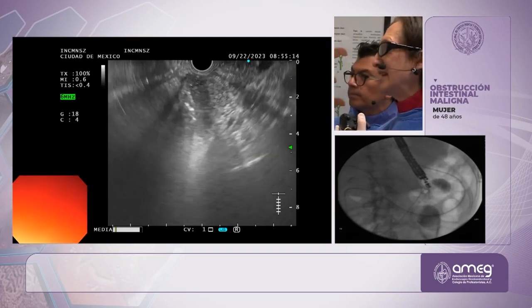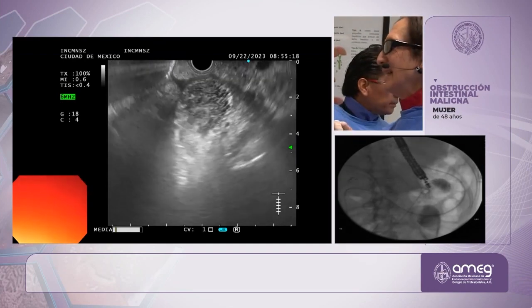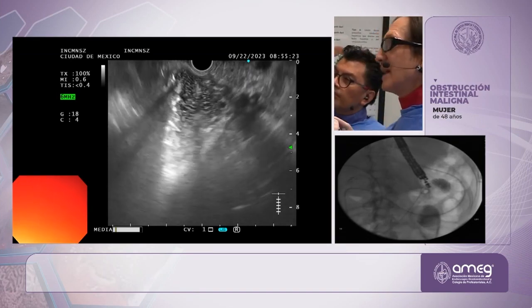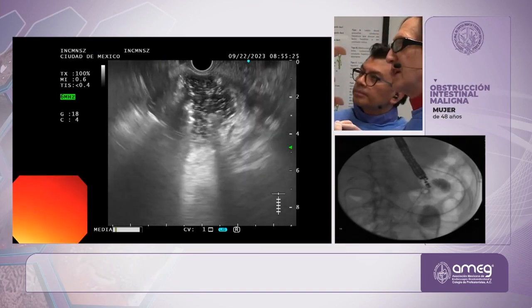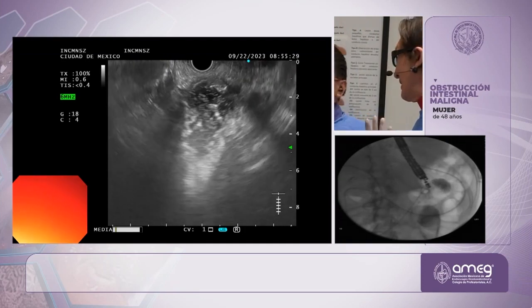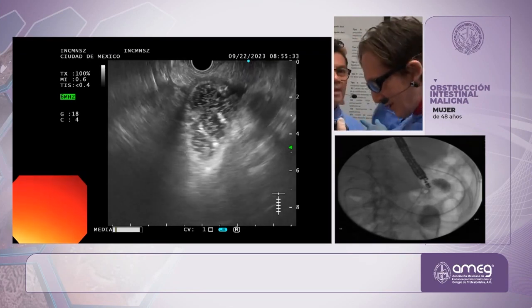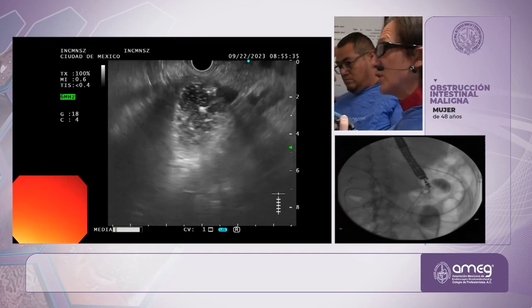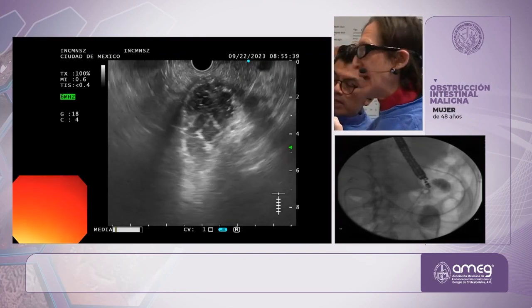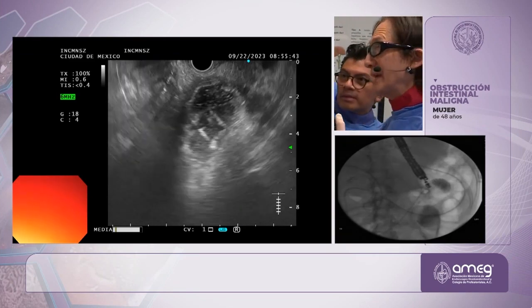Here you see that right there in front of me? It's filling. You see all the bubbles? That's our target right there. Now, you need to be so careful, because I think we can get it ready to go. Let me give you the tips and tricks to avoid misdeployment. Okay, firstly, I've got a good spot here. Let's go ahead and get the Buscopan ready, please, or glucagon. I like to give the first half now. The second half is going to be when I go inside.